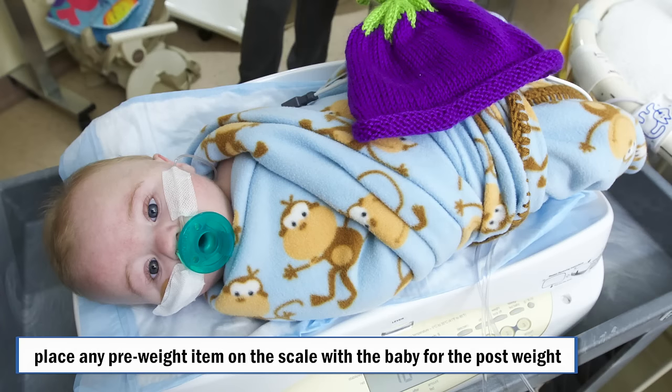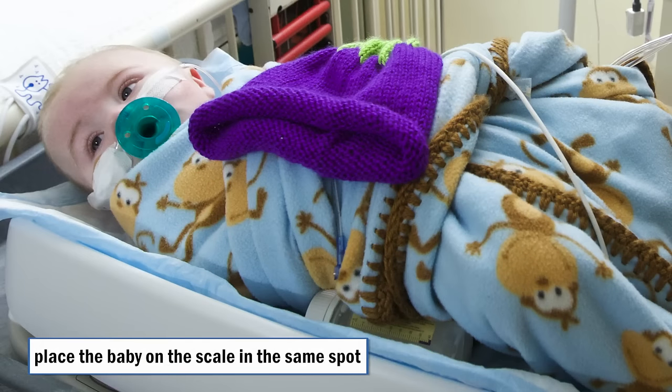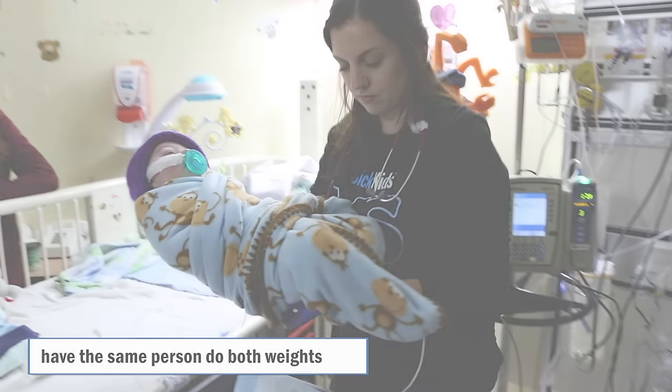A change in clothing, blanket, or pacifier between weights can also affect accuracy. If the baby had something on for the pre-weight that is no longer on by the time of the post-weight, just place it on the scale with the baby. Changing the position of the baby between weights is another factor — have the baby's head on the same side of the scale for both weights. The blanket hanging off the scale can affect accuracy, and having the same person do the weights can help with consistency.